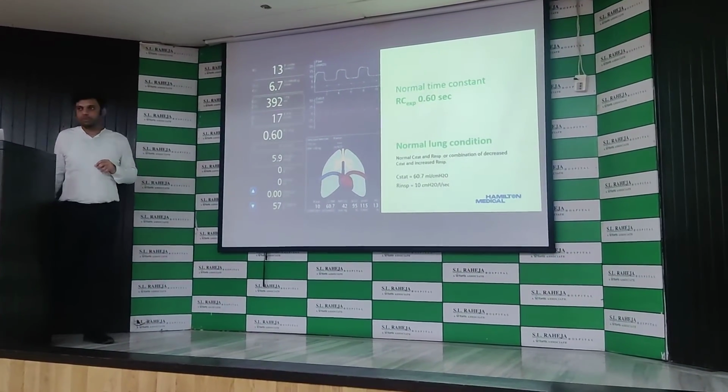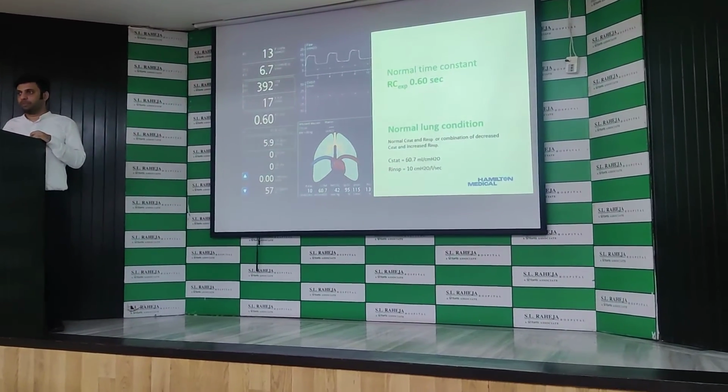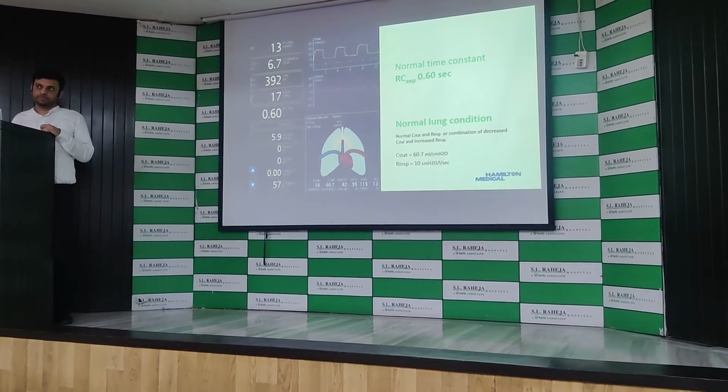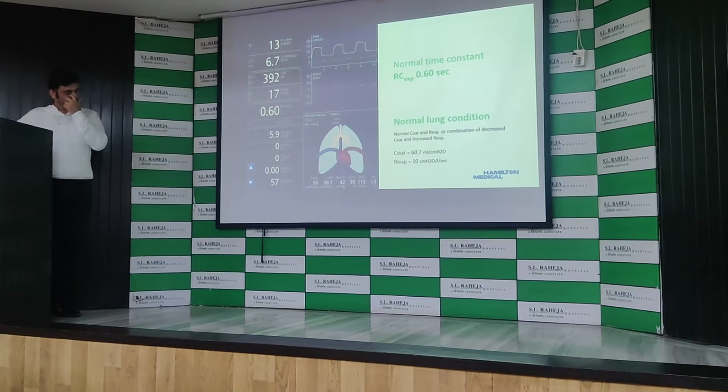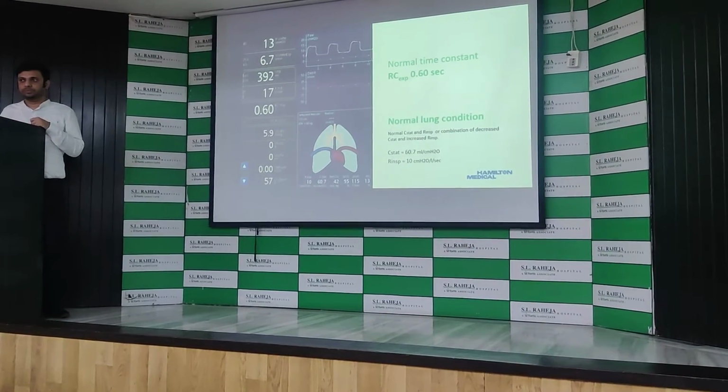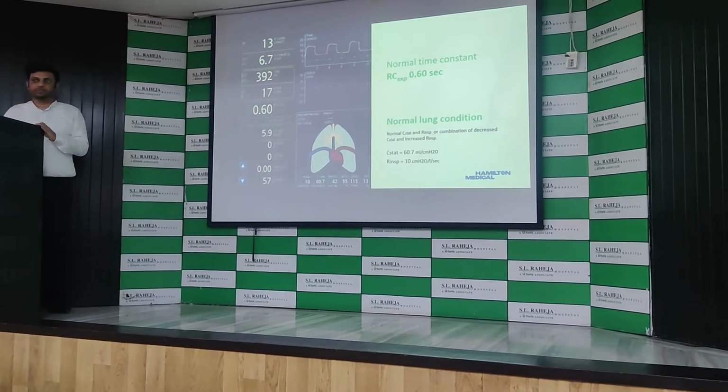Because it's poor lung compliance, it will rapidly fill the lung, so the time constant will be much lesser. It is just the volume that you are filling, 63%. Total 63% will be filled. That is what time constant is. You are understanding now?